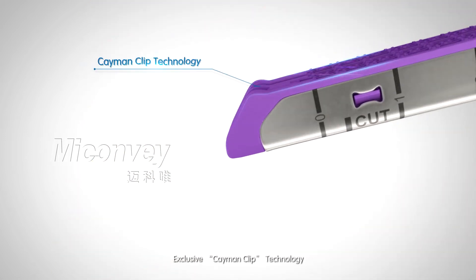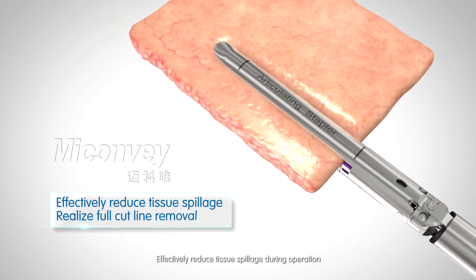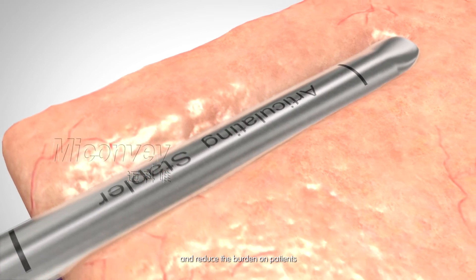Exclusive Cayman Clip Technology. Effectively reduces tissue spillage during operation, locks the tissue like a crocodile, and reduces the burden on patients.